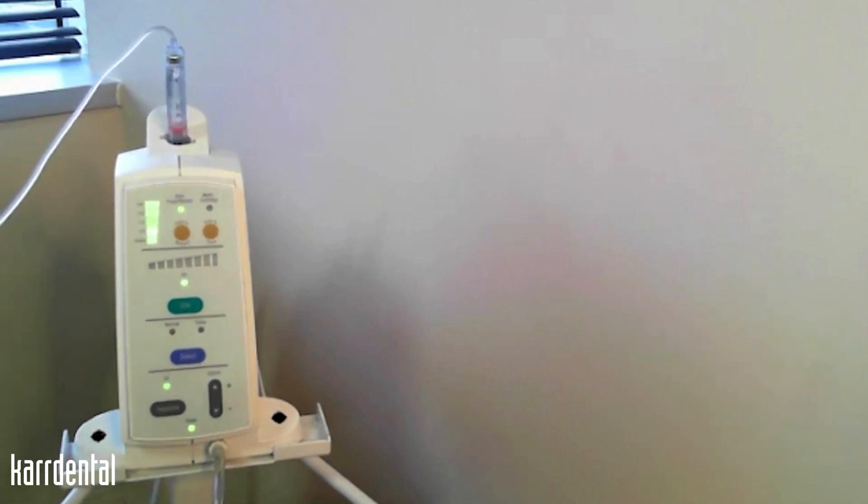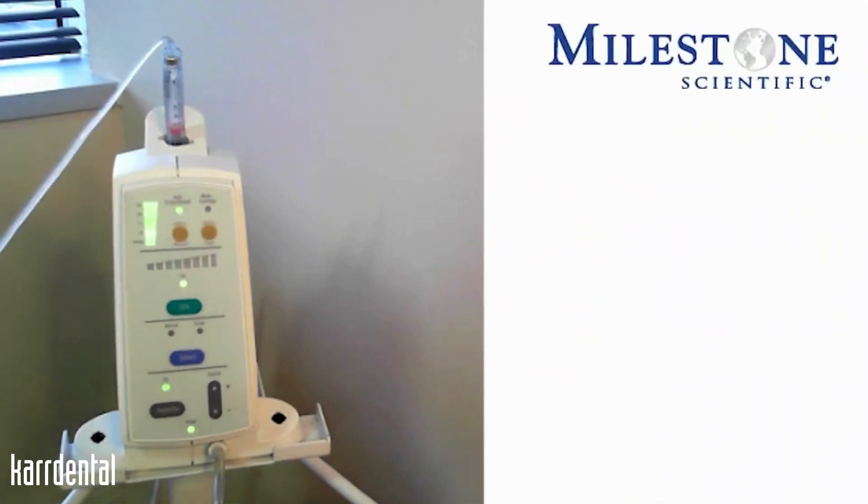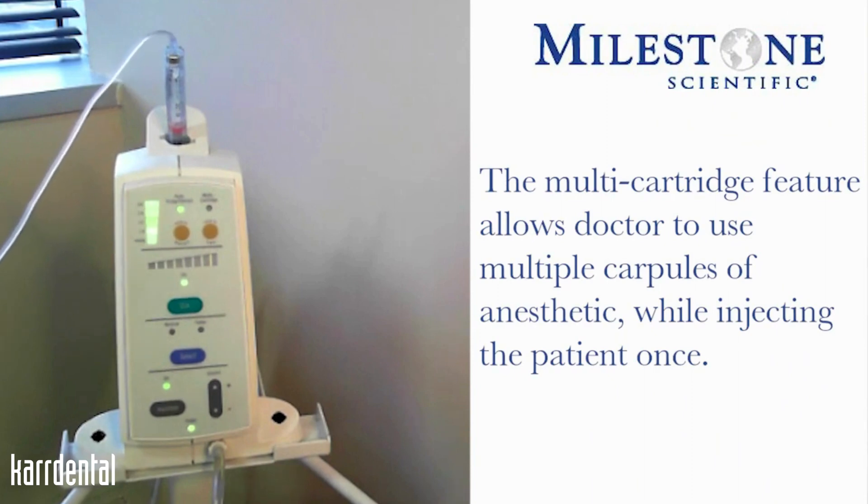You see that we have our vertical scale — that is our volume indicator — showing how much anesthesia we have in this anesthetic carpule and how much anesthetic we will be delivering to the patient. The instrument has a multi-cartridge feature, which allows you to use multiple carpules of anesthetic and inject the patient one time.